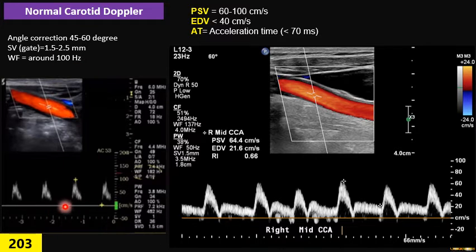The wall filter eliminates low-velocity frequencies, meaning it eliminates whatever velocity we have at the baseline. It eliminates artifacts or wall thump, the kick we get from the shaking or kicking of the wall, which creates some Doppler at this level.